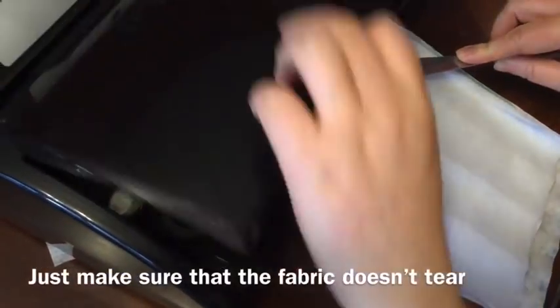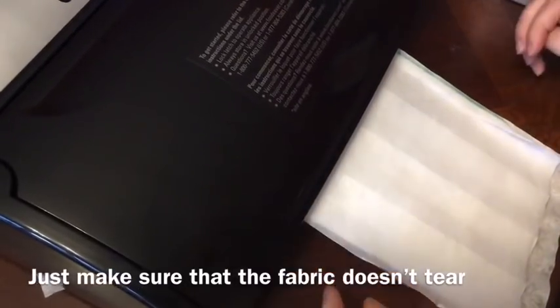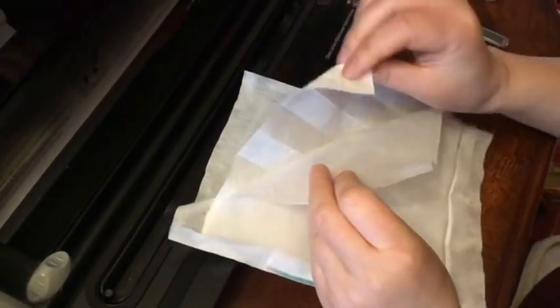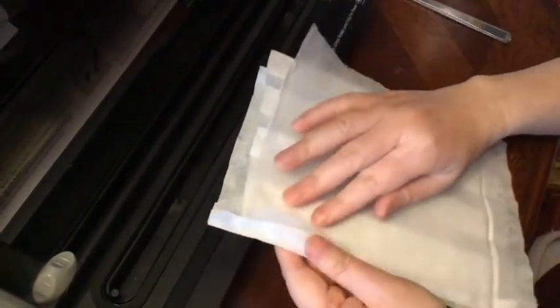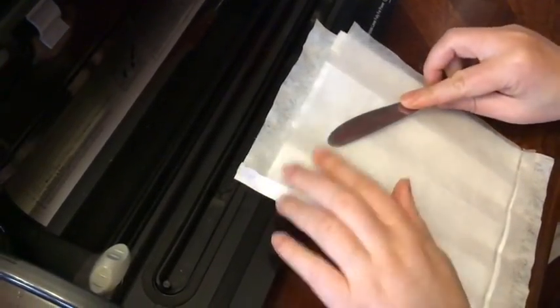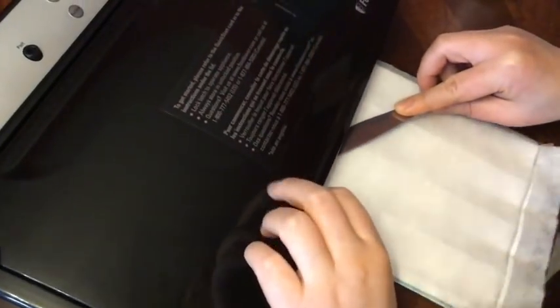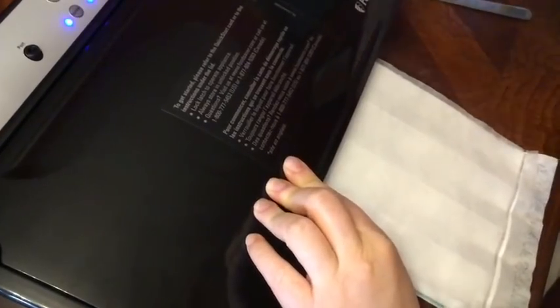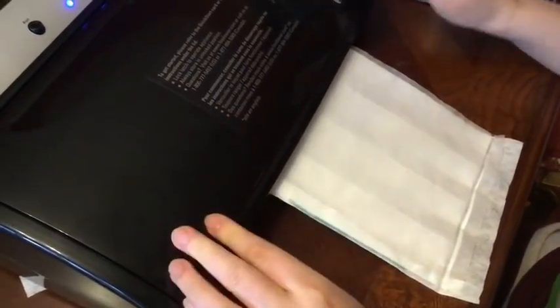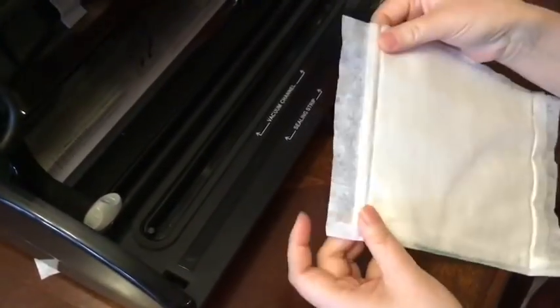I'm going to repeat this process for the other three sides, using any sterile hard object to make sure everything stays in place. Again, making sure the outermost layer is on the bottom so it doesn't melt against the sealer. I'll do this two more times and then we'll be all set.